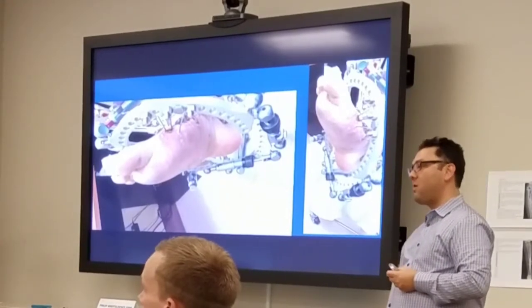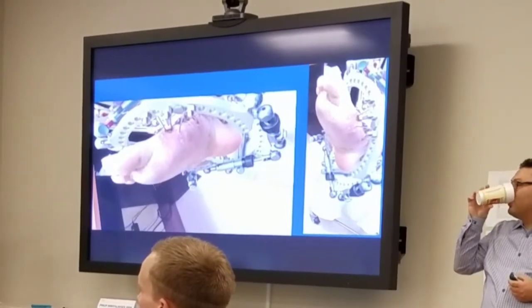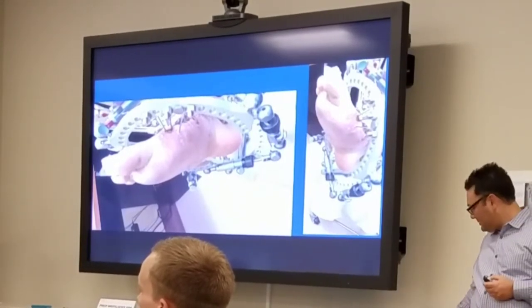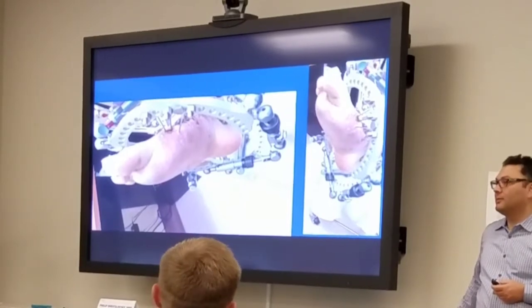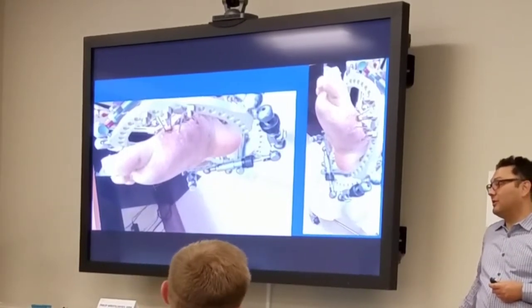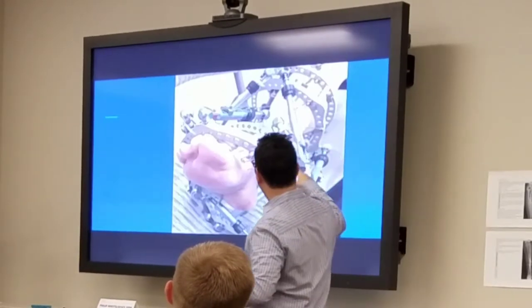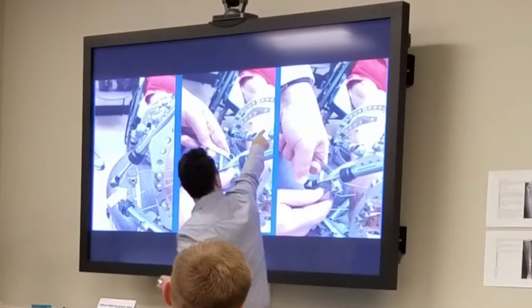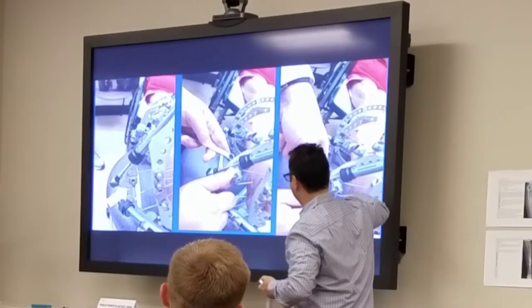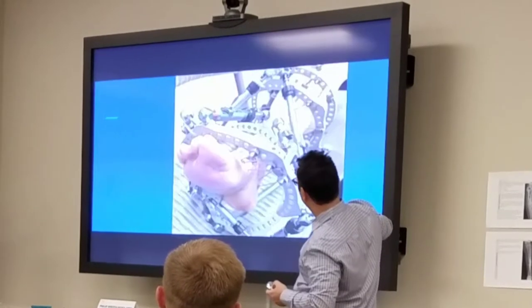The other thing was, he had a couple pop off early on, and the patient comes back and the struts are dangling. But then we went to the colored ones, because he's running two programs, so it made it easy: you get a red and a blue program. Otherwise I don't know which ones are adjusted. It's a little confusing for them, the 12 struts. I put tags on it. You see there's a little tag over there that says ankle correction, and there's one for the foot that said foot correction. I don't know where it is now.